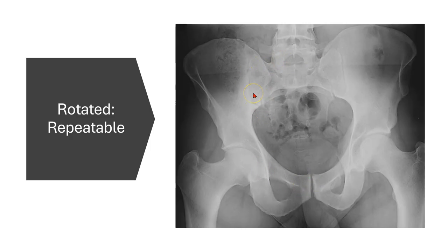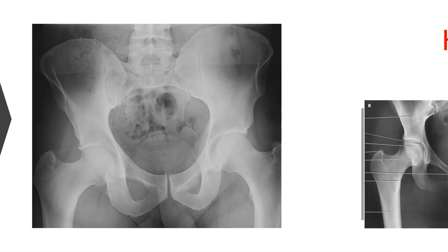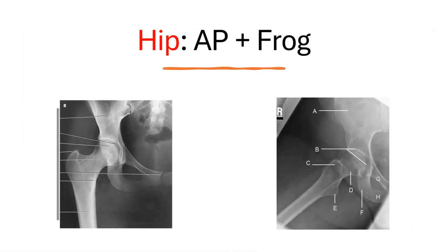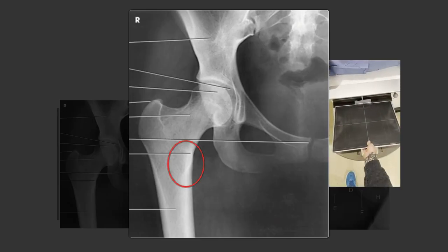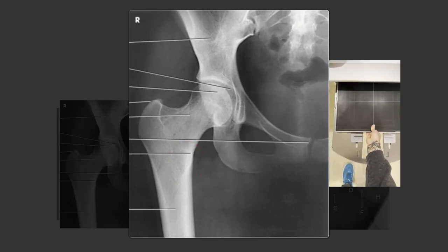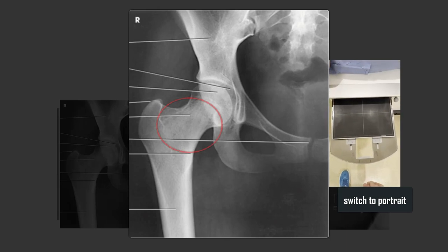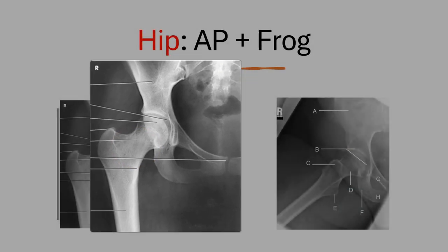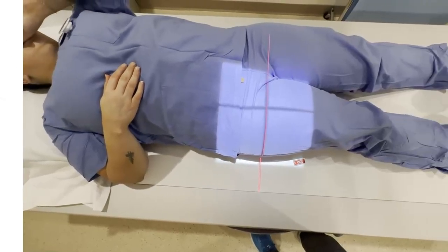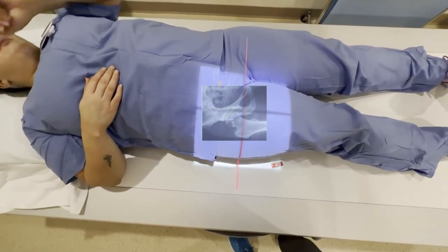Technique, everything. Taking that into account for our hip x-rays, you could see here the internal rotation causes the lesser trochanter to almost be completely hidden. And that's what we want. We got our femoral neck in profile, nice 15-degree internal rotation. So here's what our collimation should look like on Shannon's hip here. And you can see what it's going to look like if you had x-ray vision.